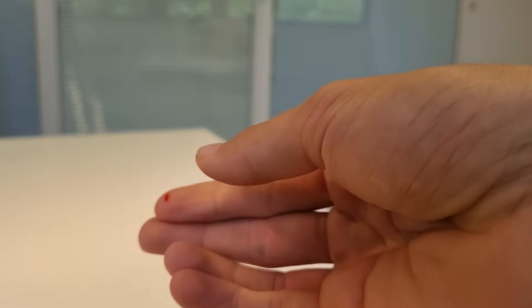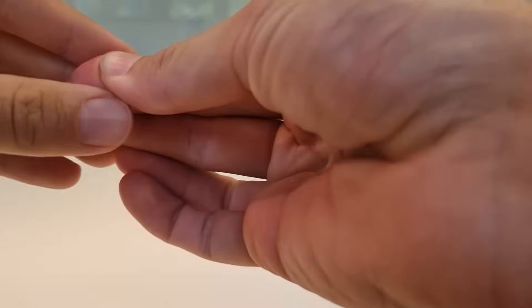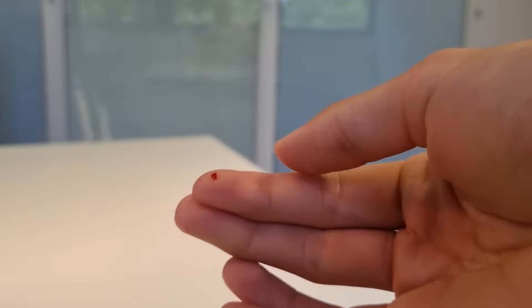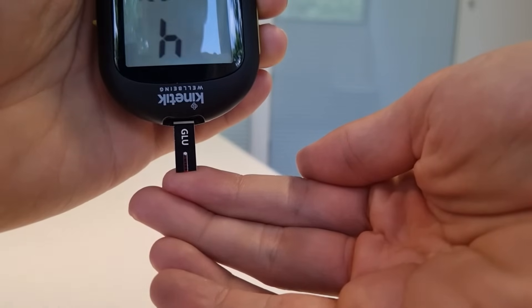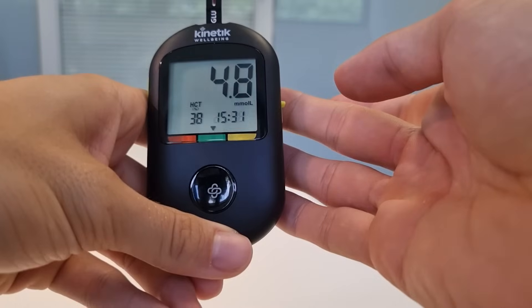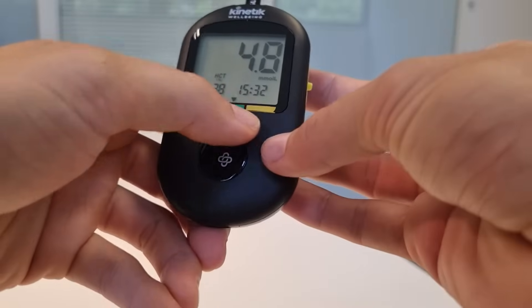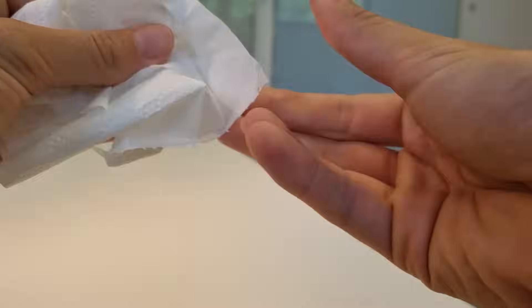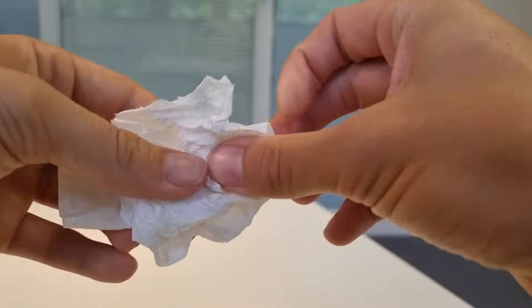It's important to never take the first droplet because this can give inaccurate readings, so I'm going to wipe that one away. I'm going to keep squeezing — I've got a nice blood sample there. I hold my device upside down and the blood automatically gets drawn up. The countdown starts and as soon as we reach one it's going to say that my blood glucose levels are 4.8. Using this indicator we can see that I'm well within the green healthy range. See, it's such a small needle that I barely felt it.